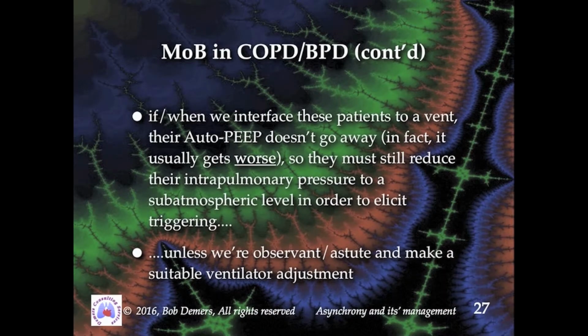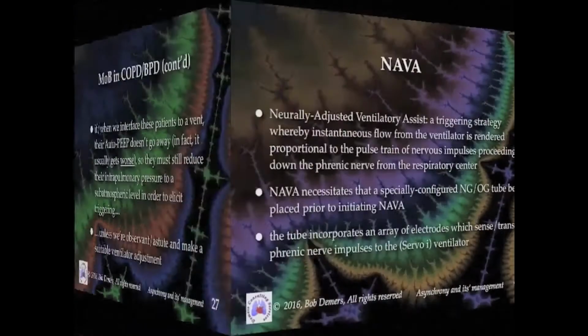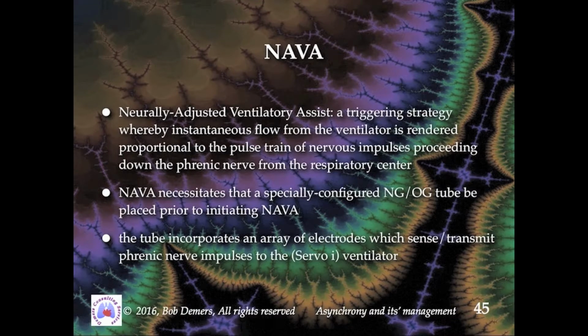To the extent that clinicians observe asynchrony in patients to whom they are assigned, it is important that they be aware of steps that can be taken to alleviate it. One simple method that requires no electronic sensors or equipment whatsoever is described, together with a second methodology, NAVA, that is offered as a feature on a particular brand and model of mechanical ventilator.